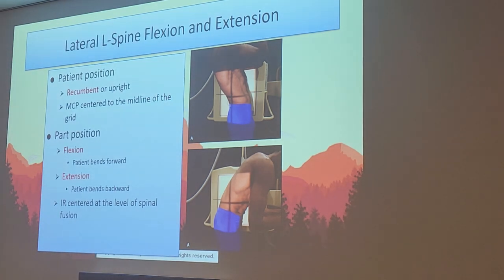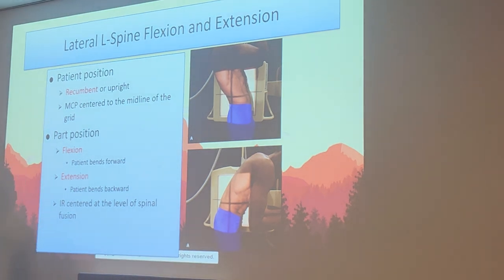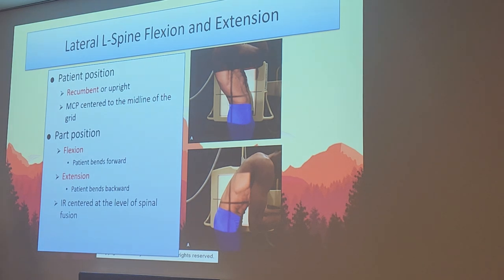Are these common? They're actually a little more common. Yeah, I've done a few of these. Even at Texas Children's, we used to do these after spinal surgeries. What level of spinal fusion? So wherever the spinal fusion is taking place, wherever the spine is fused, you're going to use that as your centering point.